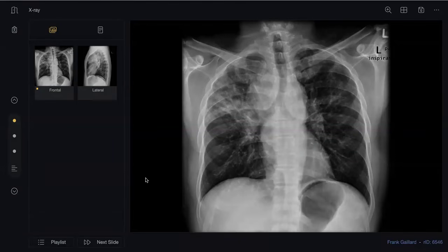So what is the next investigation here? Comparison with the prior imaging is recommended. Following this, ACE levels need to be evaluated for final diagnosis. And along with ACE levels, any other blood test? Calcium levels. Yes. And how will you confirm the diagnosis? The diagnosis is usually confirmed through these blood tests and the HRCT findings. However, suppose the blood tests are negative, then the biopsy needs to be done.